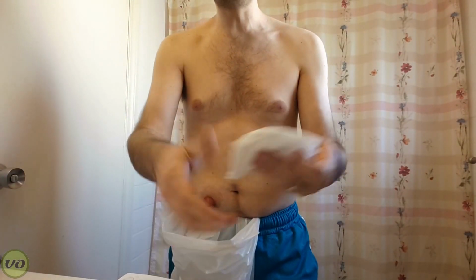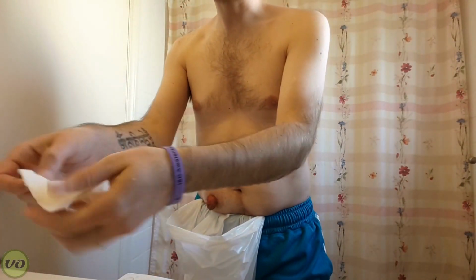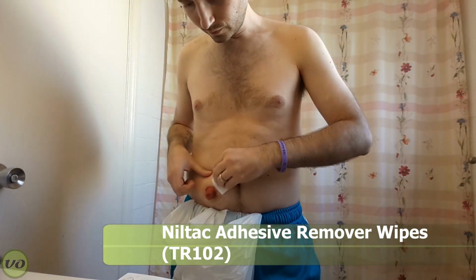So at this point, you really don't have to do anything special. If there's any residue, you do want to remove it with an adhesive remover wipe. I'm going to just quickly wipe the area off, and I'll see as I go if there's any residue. And there is actually from the barrier ring that I was using. So once I've got this all cleaned up, I'm just going to take the wipe here.